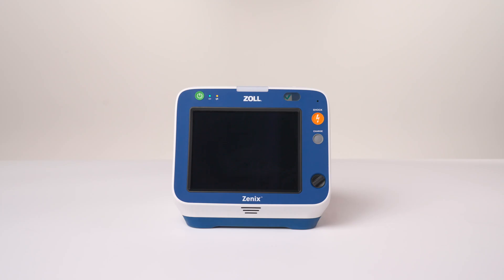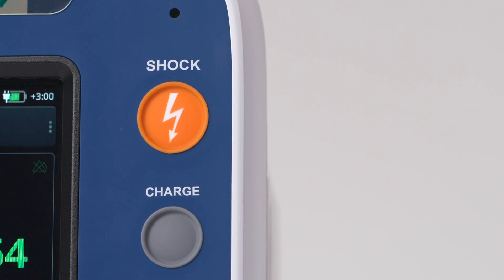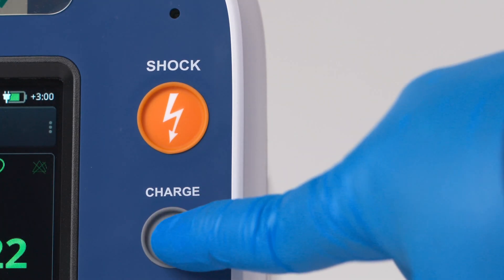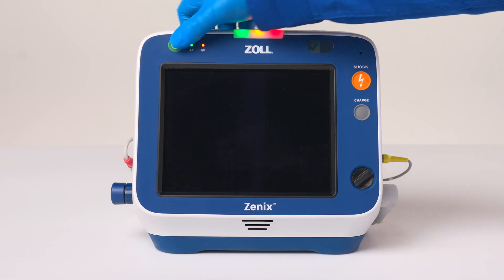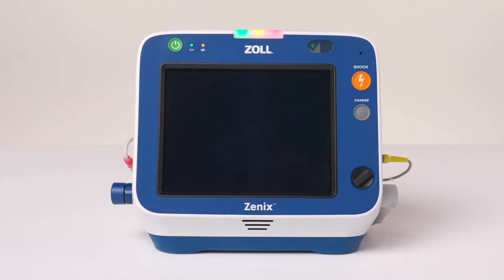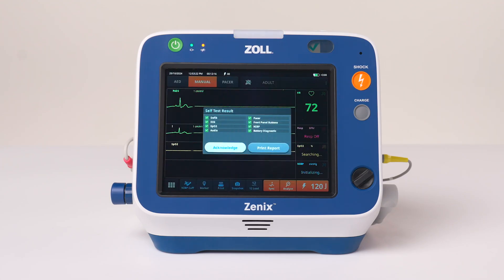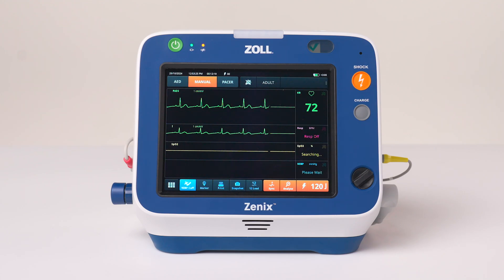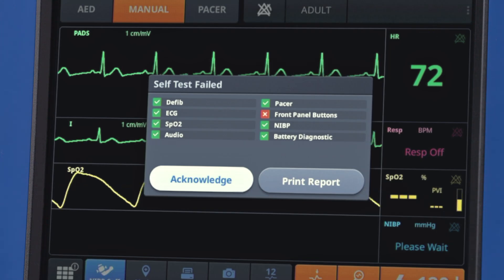On the right side of the device is the grey charge button, which charges the defibrillator. Above the charge button is the orange shock button, which will illuminate when the device is ready to deliver a shock. On startup, Xenix performs a power-on self-test and briefly displays the results on the screen. In the event of a self-test failure, the results remain on the screen. Providers can review and acknowledge the results and print a self-test report.